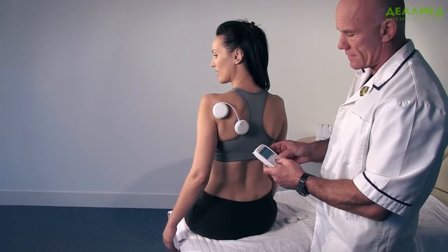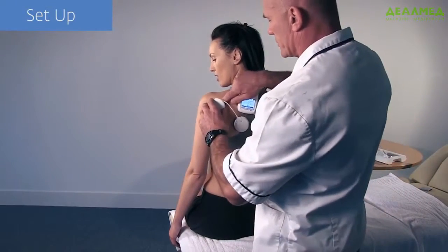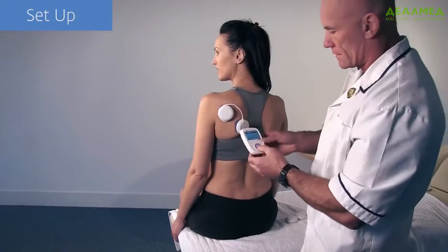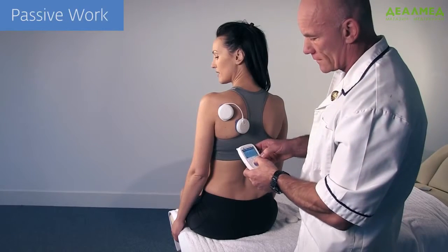In this example, we are looking to work the shoulder's external rotators. However, we see that we are getting shoulder extension instead. Simply pausing the wireless professional and repositioning the electrodes results in our desired outcome.